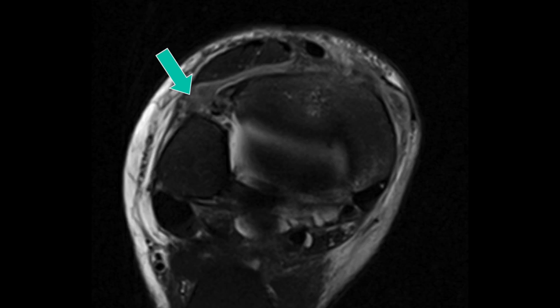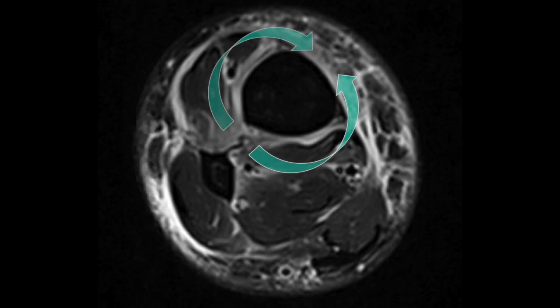Axial MRIs show the ligament avulsed from the fibular attachment site, and we can see fluid extending along the interosseous membrane above the ankle joint line as periosteal edema.